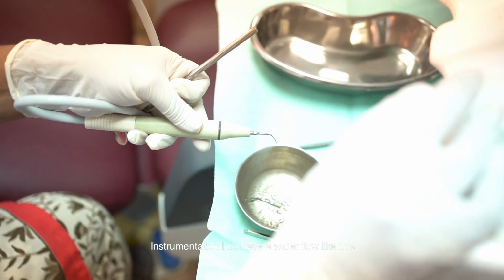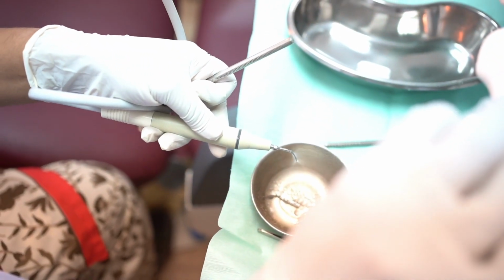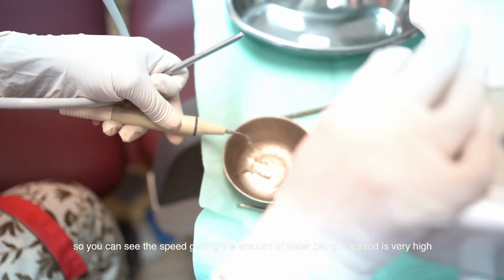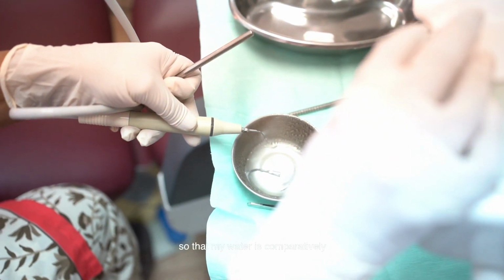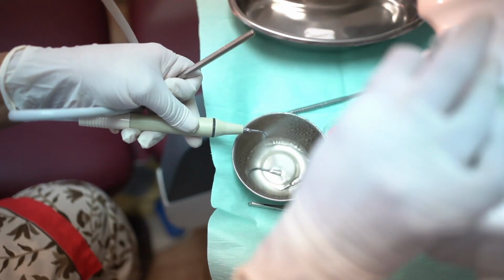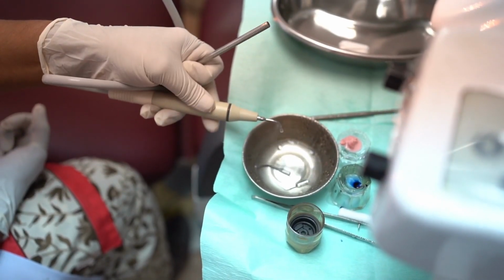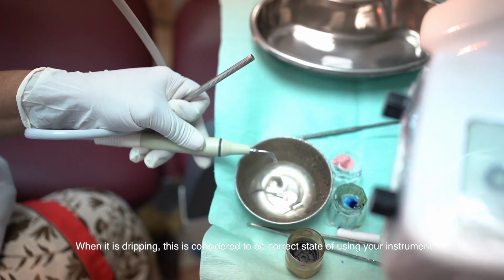During instrumentation, I have a water flow like this. So you can see the amount of water being released is very high. So I reduce it so that my water is comparatively at this speed. Exactly when it is dripping, this is considered to be the correct stage of using your instrument.